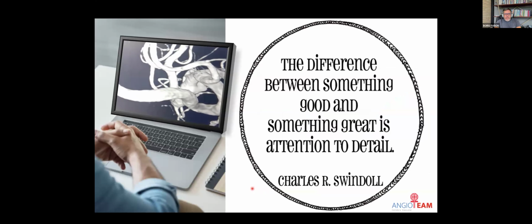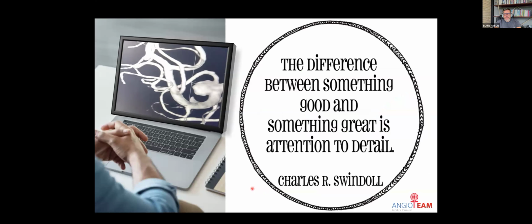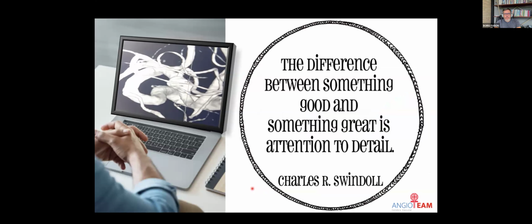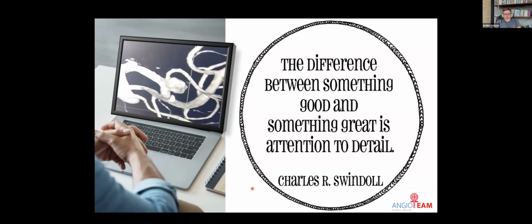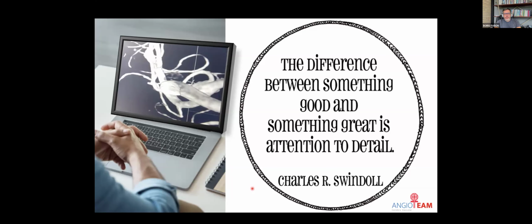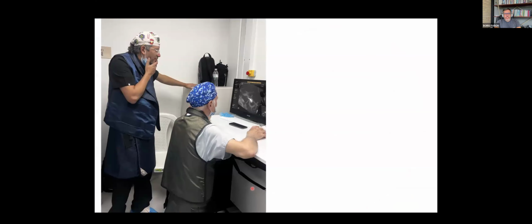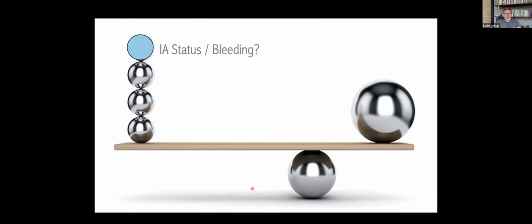One of my major pieces of advice in terms of intrasaccular technologies is that the difference is completely dependent on obsessive attention to detail. You have to check how your branches look, how the device looks, how the shape looks, take different measurements, and not just sit in front of the screen. This is Professor Moret visiting us in Medellin, Colombia, and you may see here people with vast experience dedicated to checking every measurement in order to get the perfect device.